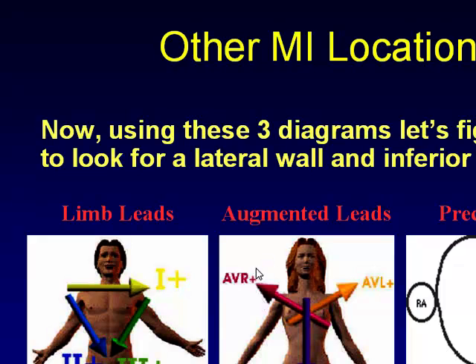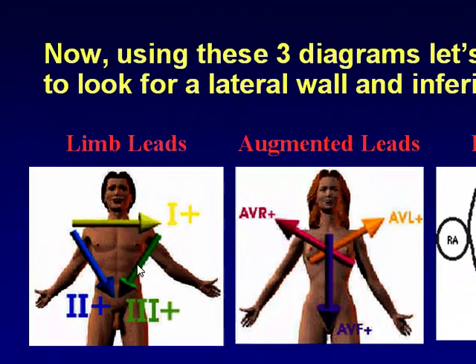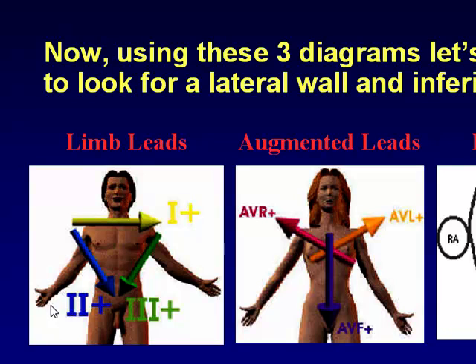But what about the right side of the heart? We only have one lead, which is AVR. Only the AVR is looking to the right side of the heart. Actually, the inferior myocardial infarction can be seen by which leads? L2, L3, and AVF. Two leads from the standard limb leads, and also one from the augmented limb leads can tell us about the inferior myocardial infarction.